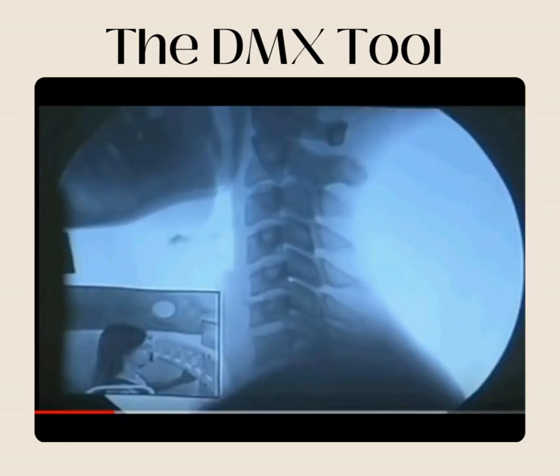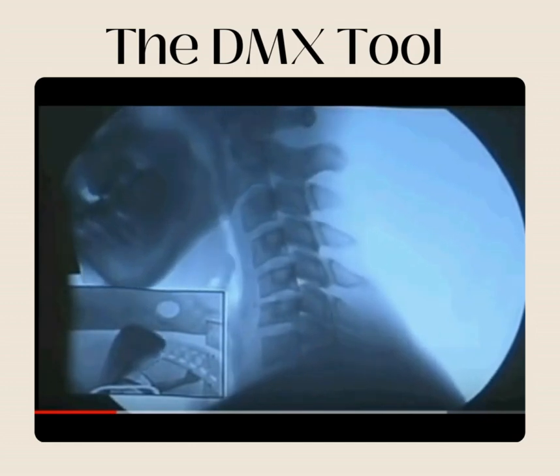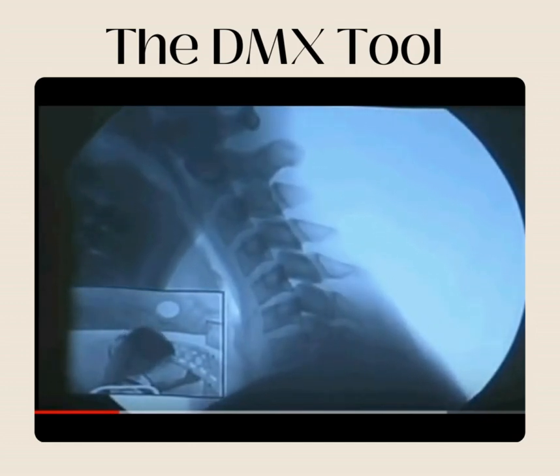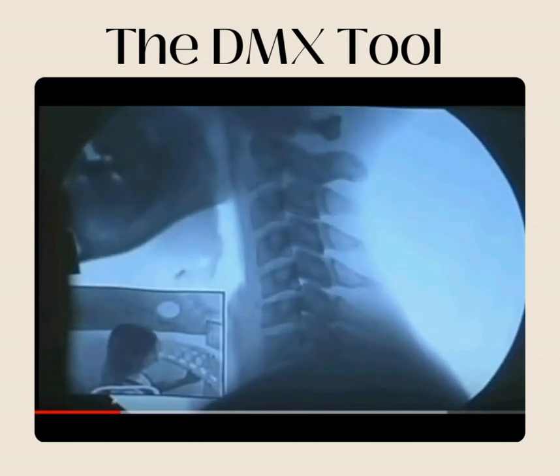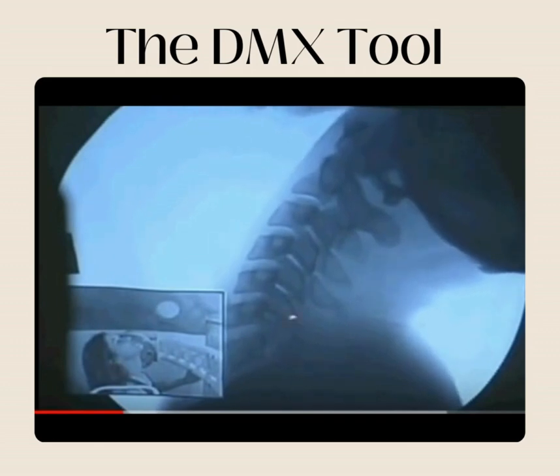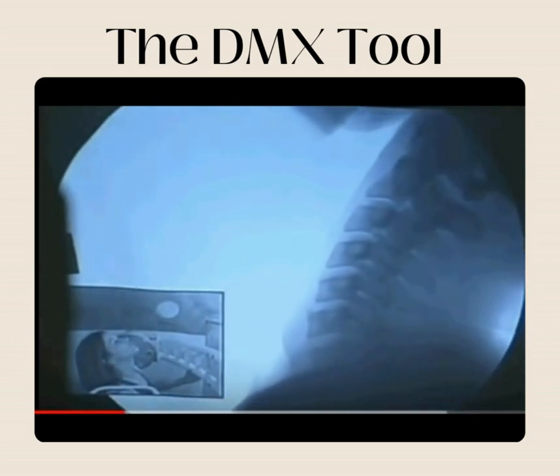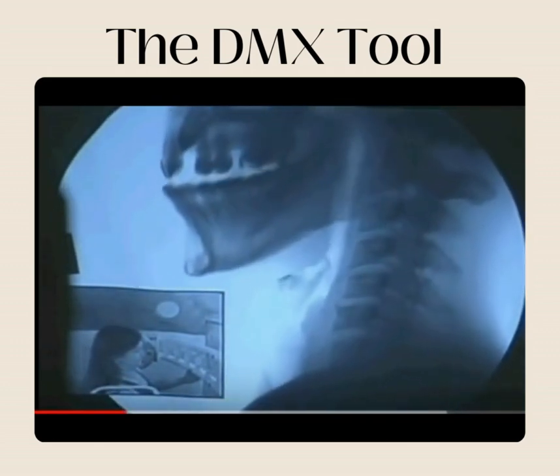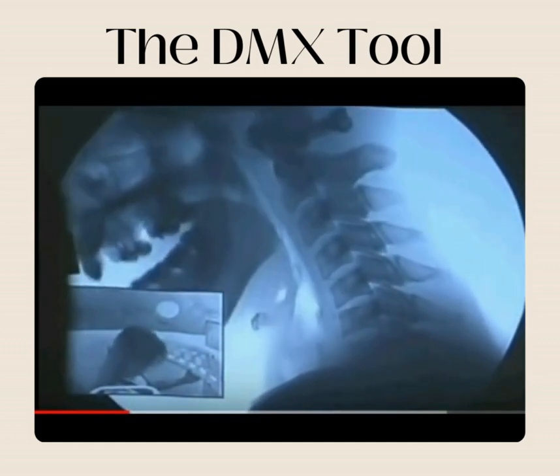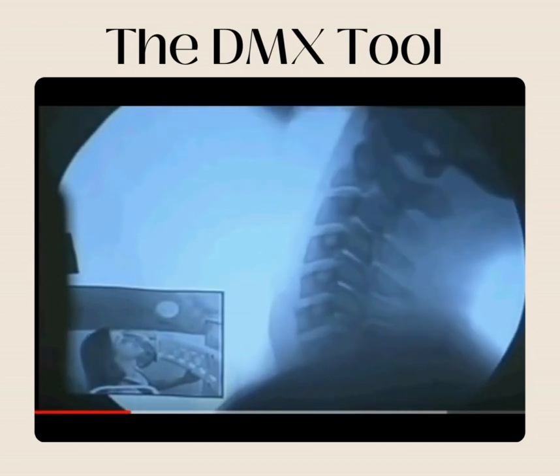Now we did one other thing with this technology, because the lawyers always said, why can't I see my client? State Farm thinks you guys are throwing x-rays at me of someone else. So we added a picture-in-picture board, so we digitally look at your patient on the outside. So we see Susie here, and we're looking inside simultaneously. It becomes alive. Everybody loves watching movies today. We send this to the insurance adjusters. They go nuts. It scares the heck out of them, and they just want to settle.